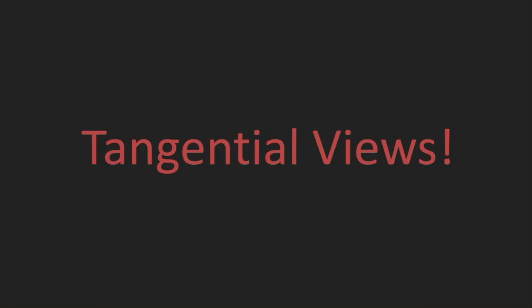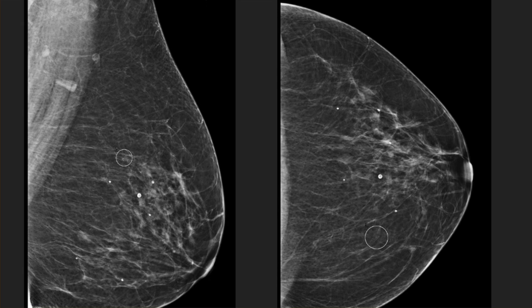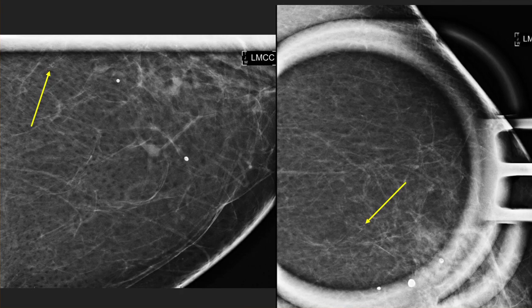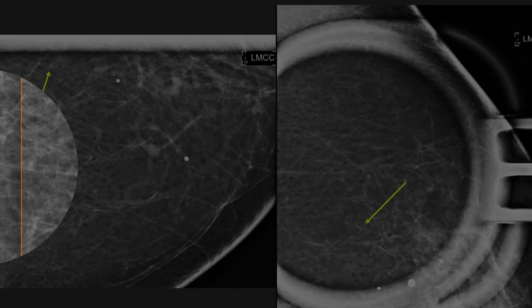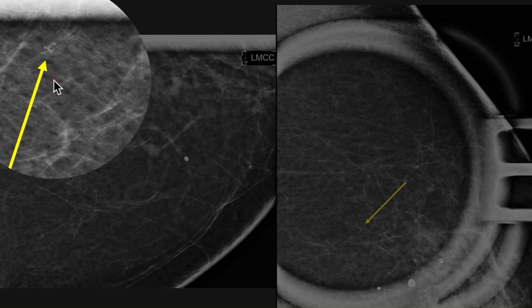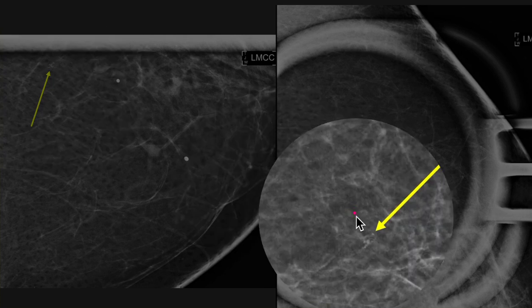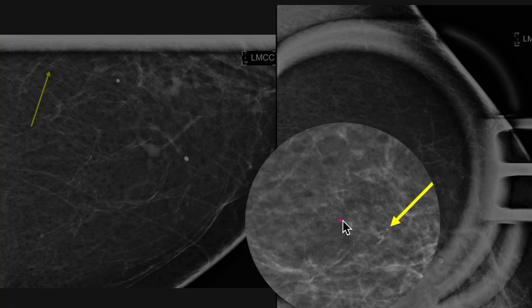So in those cases where we can't be sure, we have to do the tangential views. The interpreting radiologist has marked a group of calcifications in two views that were new and needed further additional workup. Here are the typical MAG CC and MAG ML views — you can see these funky-looking calcs and you're thinking: are those fine pleomorphic? Are they dystrophic? Are they grouped round calcs? Not 100% sure, but definitely need some further workup. You could even wonder if they have a little bit of a linear orientation to at least some of them.